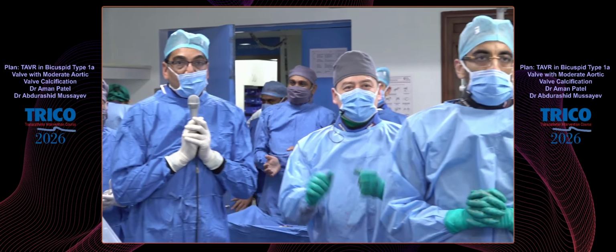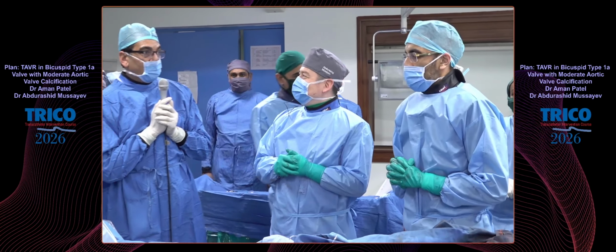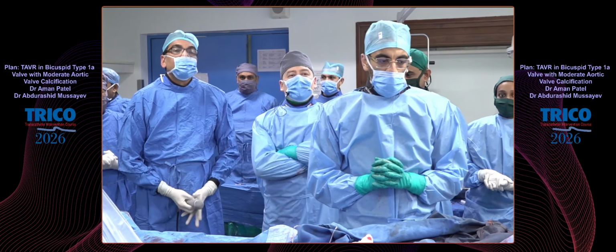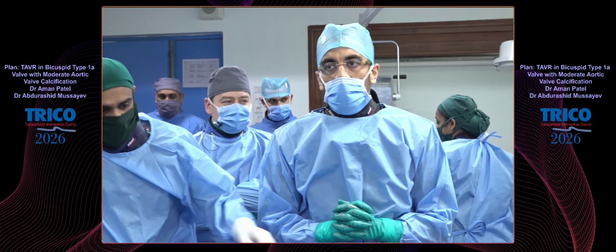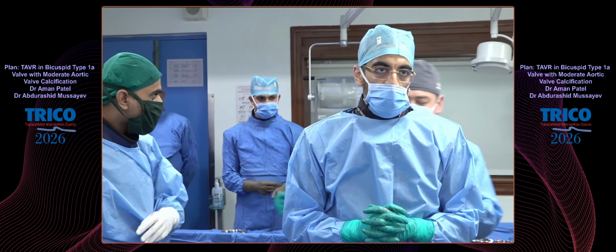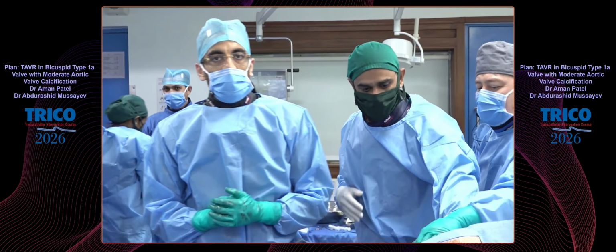Thank you. So, sir, now I would like to learn from Aman. Aman, you had some slides prepared for the bicuspid valve. Yes, because there are a lot of junior cardiologists in our delegate list who I think will like to know when you choose transcatheter aortic valve replacement over surgery. So in context to the case that we performed today, let us take a look at some learning points.